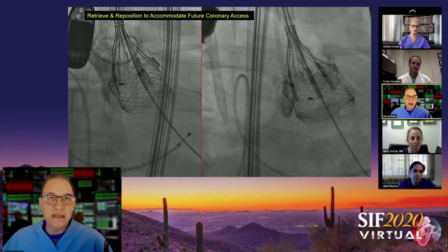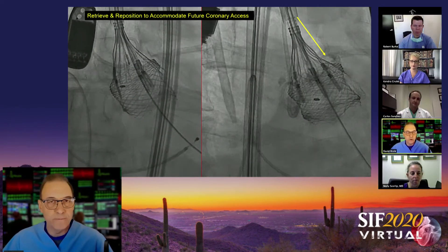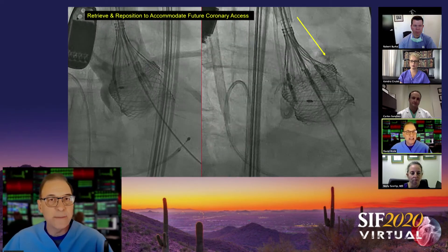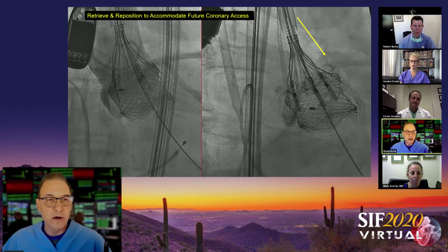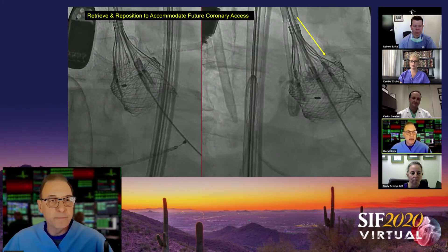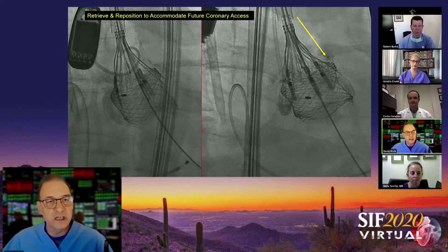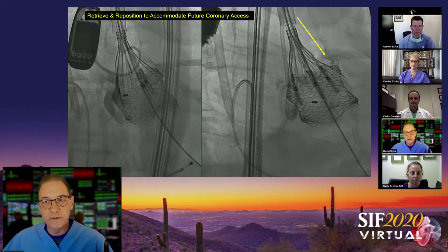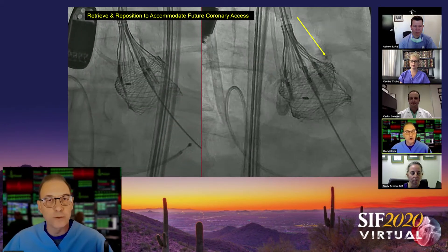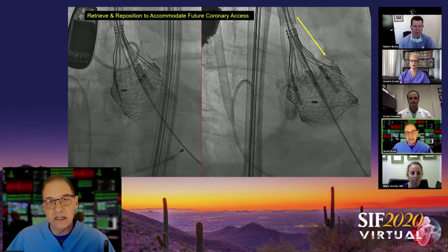The device gets high marks for the ability to retrieve and reposition. Here's a case we did not long ago. On the left panel you can see a pretty significant height to the valve deployment that partially incarcerates the left main. Simple retrieval and repositioning allows durable access into the left main coronary artery, as seen in the picture to the right.